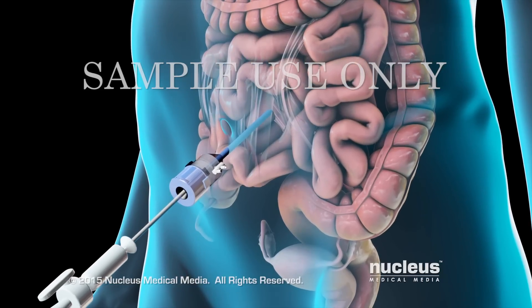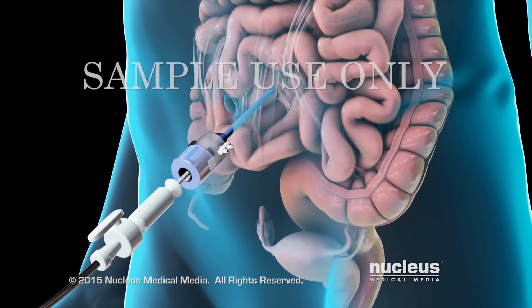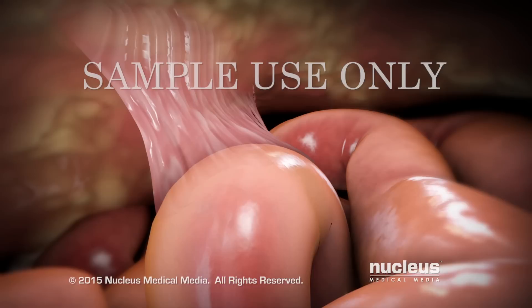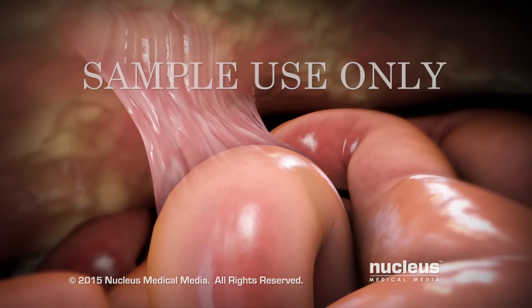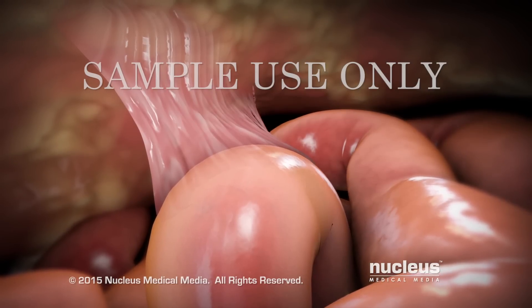He or she will insert a laparoscope, which contains a light, a camera, and a magnifying device. The laparoscope will project images onto a monitor to guide your surgeon's work.